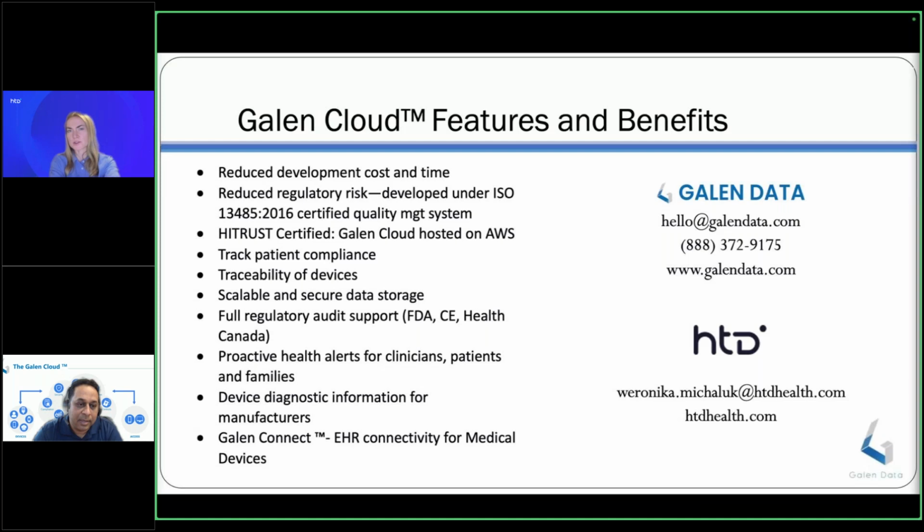So whether it's software as a medical device or not, it depends. The wording here is clinical decision support system, and the FDA has a specific category for that. Yes, so clinical decision support could be SaMD, but doesn't have to be. It all depends on how you frame your intended use.